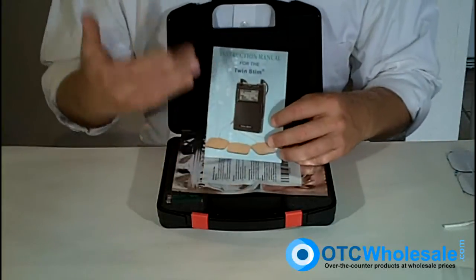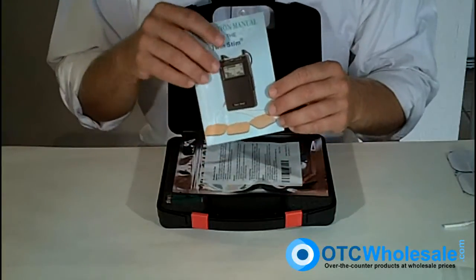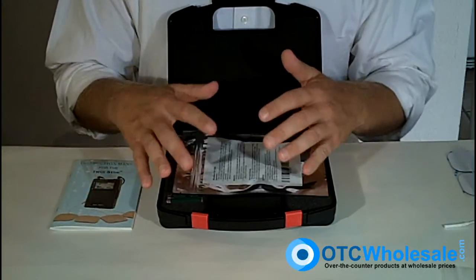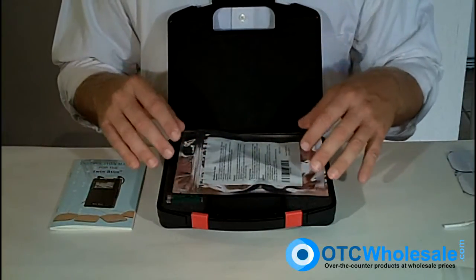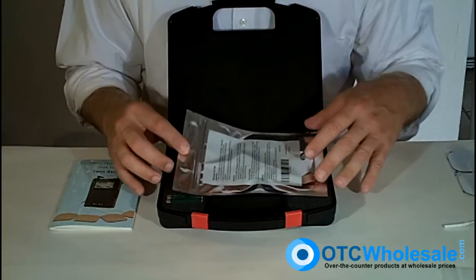The Twin Stim comes with a comprehensive 40-page manual — very easy read, in very clear English. It's also supported by a distributor here in America that supports its warranties and product. Here at OTC Wholesale, we have some of the best prices on Twin Stims in the marketplace as well.